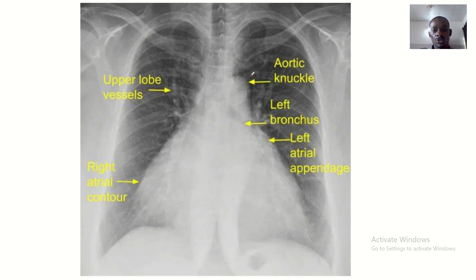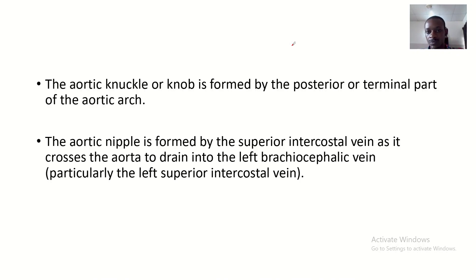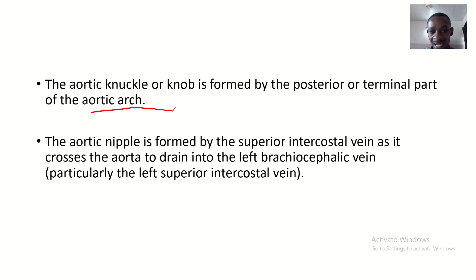Here is an X-ray, and what we are focusing on is the aortic knuckle. The aortic knuckle or knob is formed by the posterior or terminal part of the aortic arch.